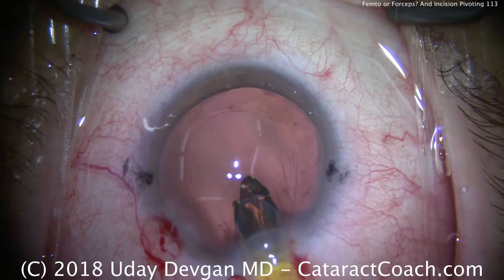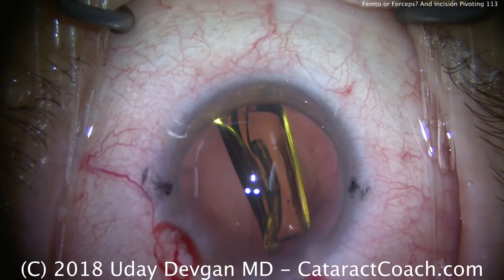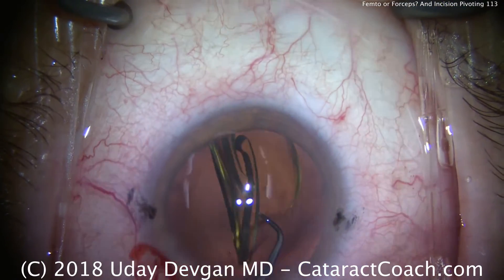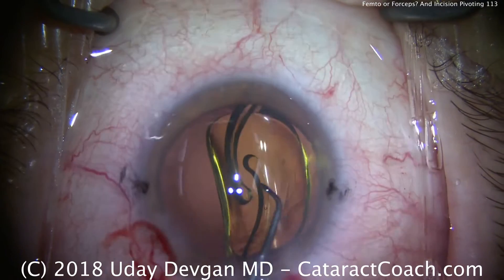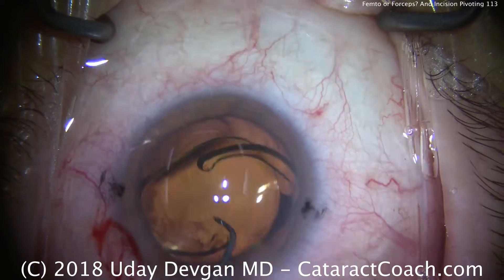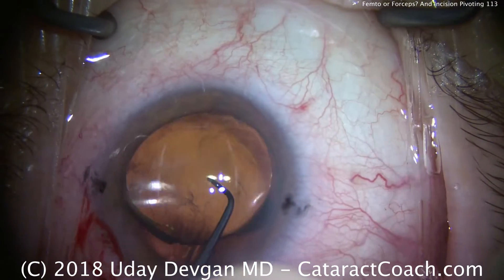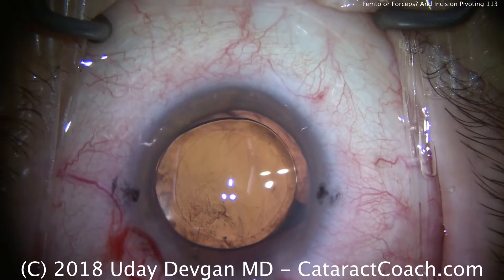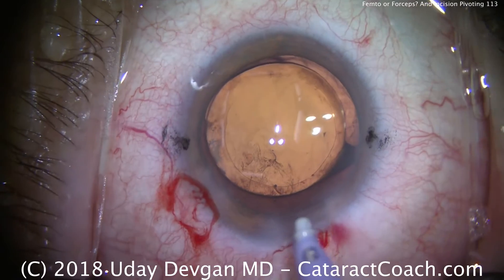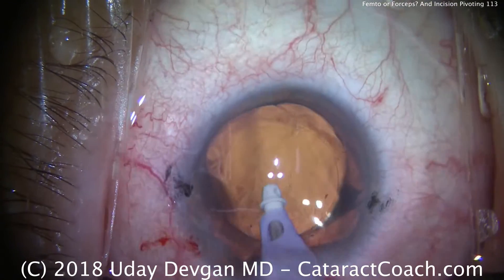The key here is again to keep the eye in primary, clear it under the nasal rhexis edge, deliver the whole lens, get the second instrument, and dial the lens where we want it. Pivoting is very important in this surgery. Even if you go on to change specialties and do full-time vitreoretinal surgery, that surgery is even more dependent on the ability to pivot with the incisions. In fact, you control eye position and access inside the eye with pivoting in VR surgery.